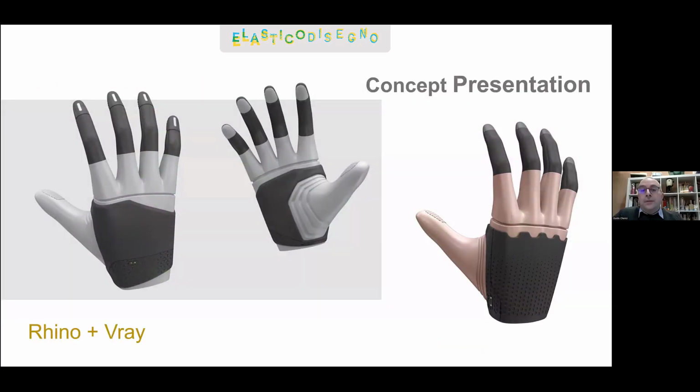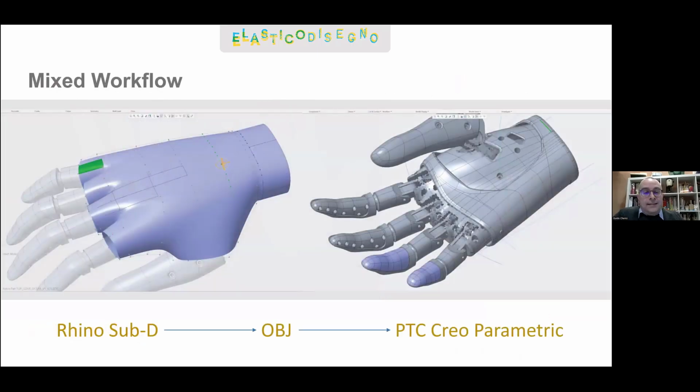And so we achieved a series of concepts that we presented with Rhino, and they were usually rendered with V-Ray. At this point, we had some concepts that the client approved, and that moved on to the next phase. And in this case, both our studio and Prensilia, our client, work with Creo, parametric modeling software by PTC.